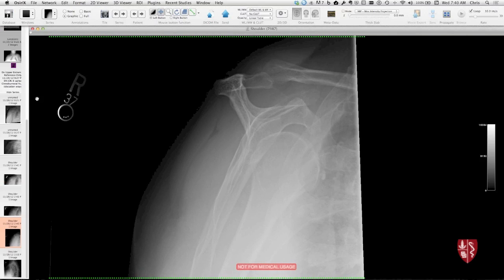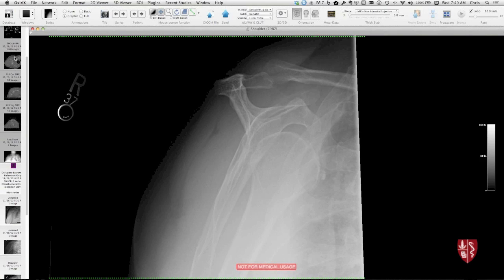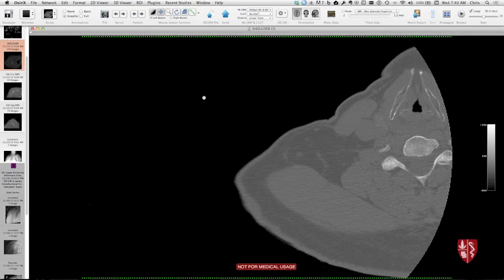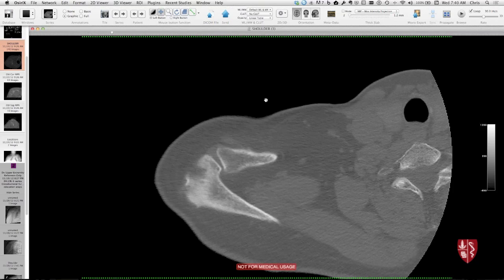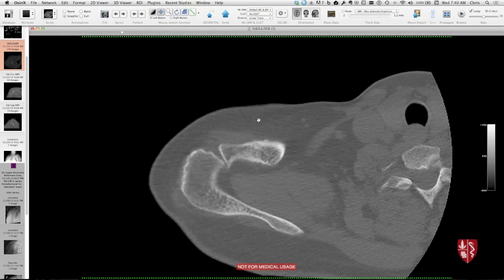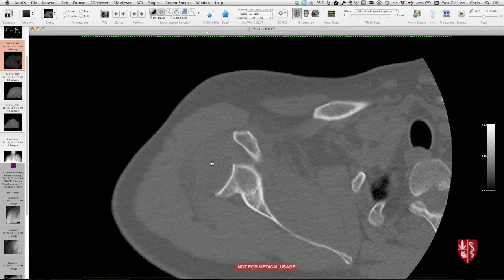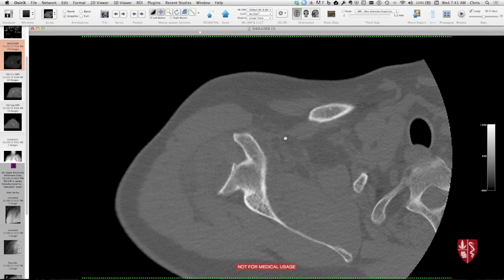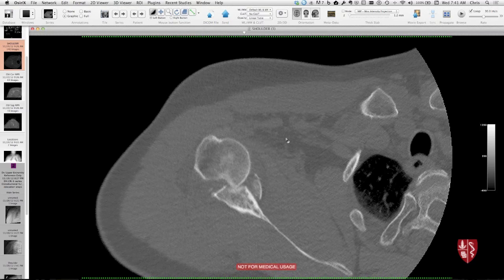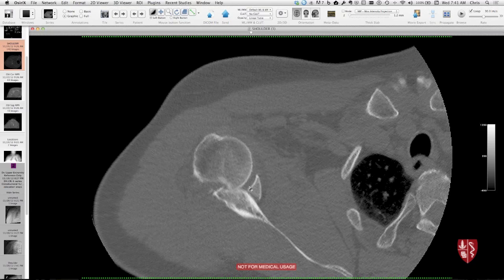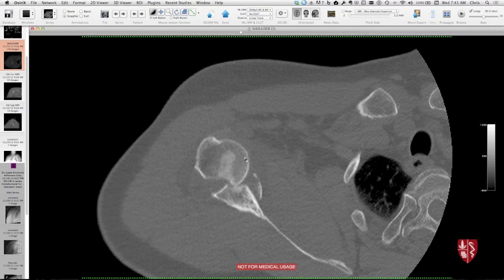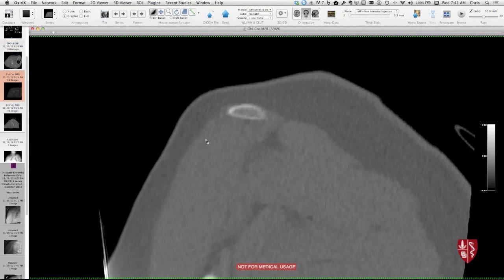This patient had a CT scan that I wanted to show briefly, because a lot of times these complex shoulder injuries end up needing CT to define the bony anatomy and sometimes the orientation of the dislocation. So here's axial CT coming from top to bottom — clavicle, acromion, coming down into the glenoid here. And when you get to the glenoid, you should be seeing the humeral head, but it's not there. Here's the coracoid process. And as you get inferiorly, the humeral head's still dislocated at the time of the CT, probably because there's a big fracture involving the anterior inferior glenoid. And then there's also fracture involving the humeral head, some impaction here. So that's a fracture and dislocation.